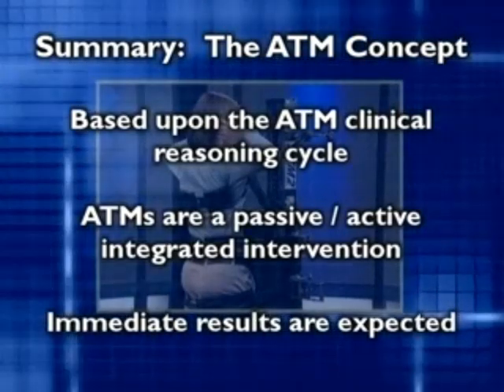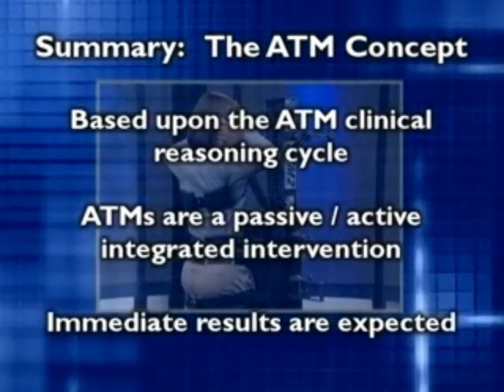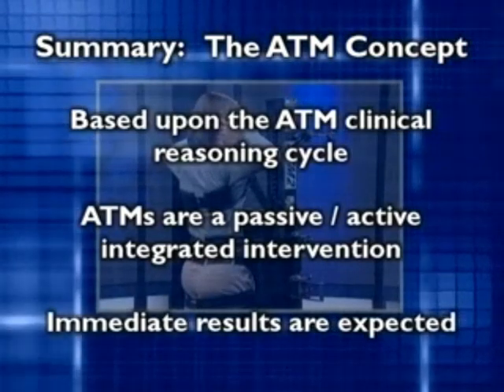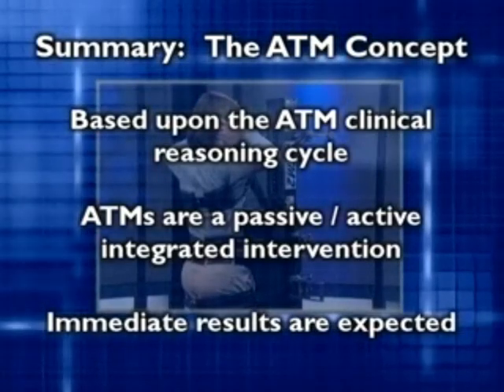Learning how to use the ATM2 is logical, easy, and straightforward. This concept enables clinicians to continuously monitor their actions in relation to the outcome and encourages them to create a real difference to their patient's suffering.